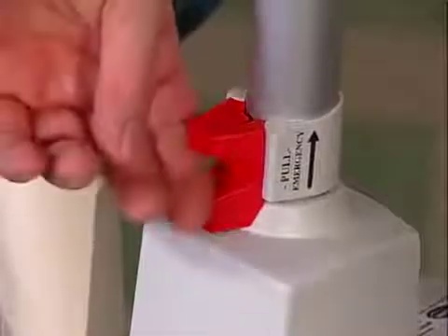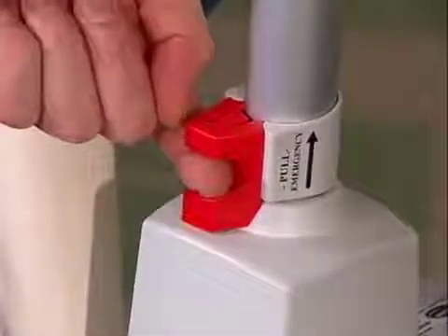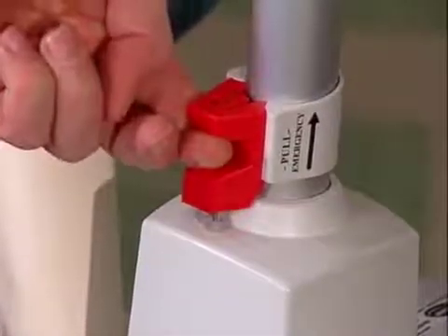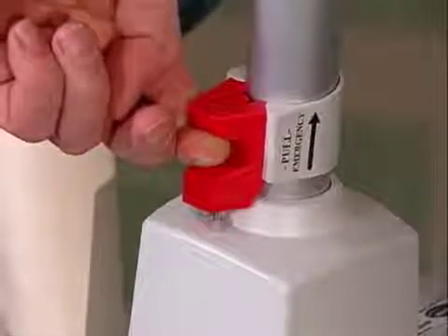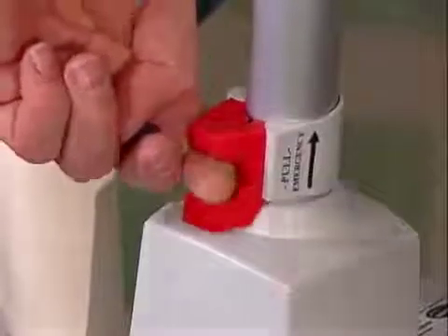The secondary emergency release on the Jasmine lift is located on the actuator. Pull up on the red emergency sleeve. This will slowly lower the boom. There must be weight on the boom for this mechanical release to function.